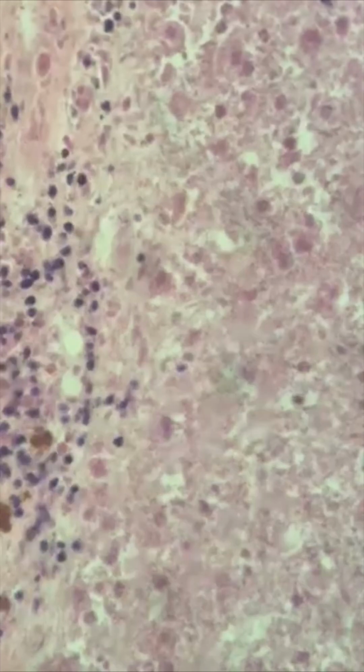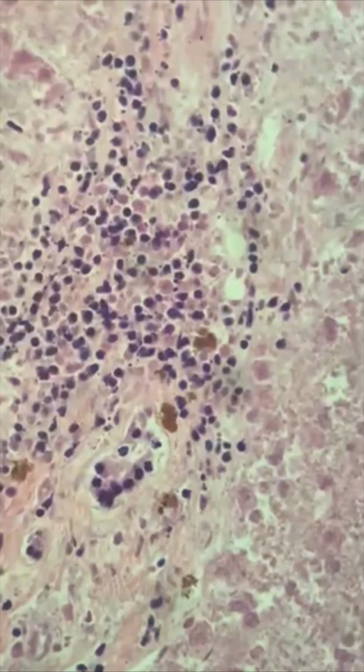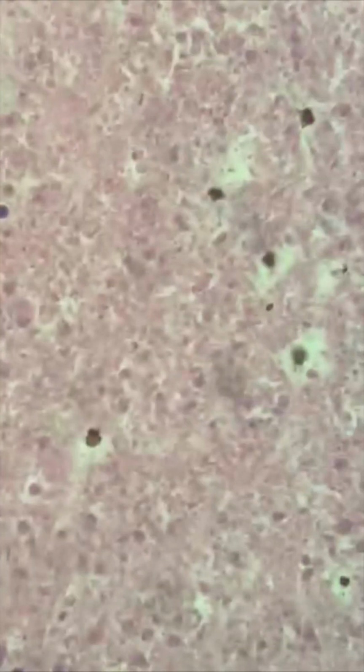Here are sections of liver. You can see that the liver is completely necrotic, perhaps due to a failing heart without oxygen, or lungs without oxygenation. So I'm going to go down just to convince you that this is definitely liver tissue, all necrotic from ischemia. And you can see even a little bile pigmentation increase or whatever, and there's some slight inflammation around the portal triads. But look at how necrotic these liver cells are, the liver plates.